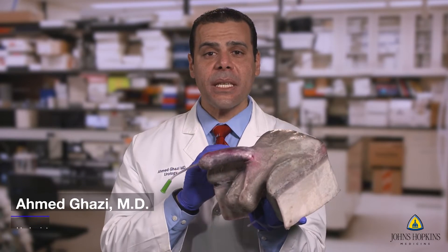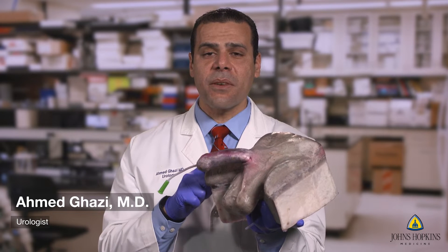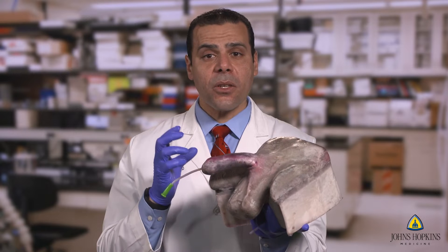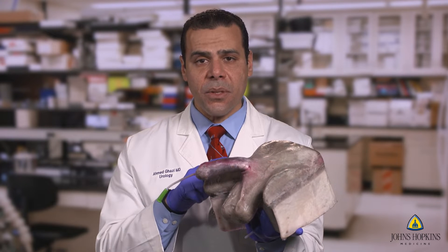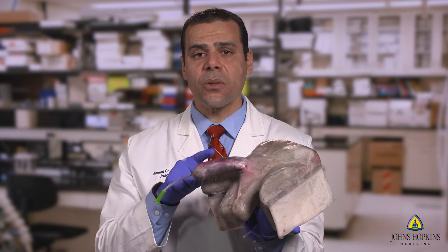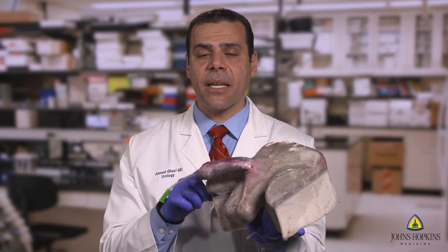This is our penile prosthesis model, and this was one of the first models that we developed through a consensus-based approach. That means we got a group of experts that came together and agreed on what are the key steps to train for this procedure and what components required to be placed in a model in order to achieve that level of training.